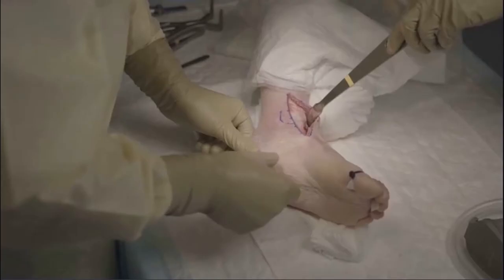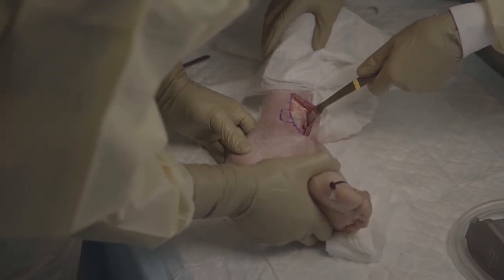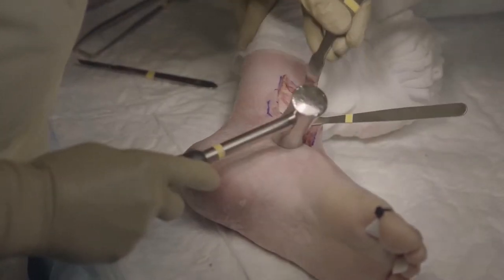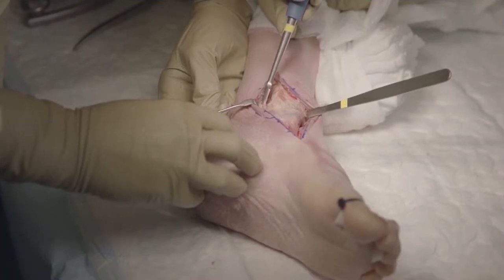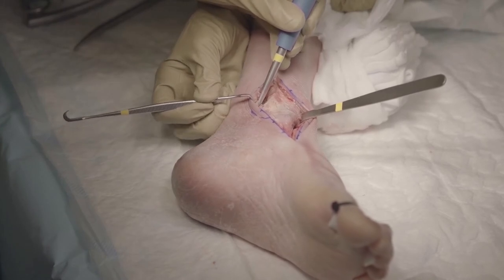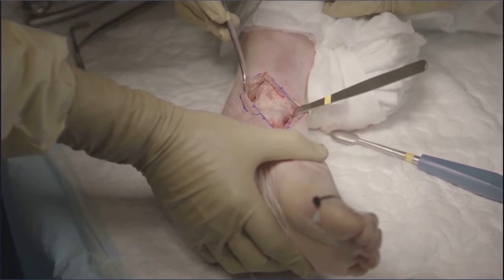We place a Hohmann retractor in order to protect the anterior structures, and we can also place a small sharp Hohmann retractor into the distal tibia. This will make it necessary for an assistant to hold it. Opening the retinaculum for the posterior tibial tendon and then with blunt dissection, with this large size blunt instrument, we go in the direction of the os trigonum and then we can place a Hohmann to protect the neurovascular structures at the back of the joint.